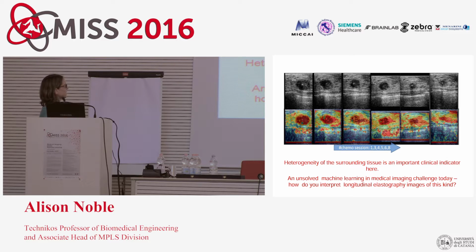Radiologists were very excited about seeing these images. So really what I believe would be very interesting to look at, if you could build the databases to do this, is to see how you could use machine learning with this sort of longitudinal data to understand if you could describe the rate of change or the success of the given chemotherapy from images of this kind.